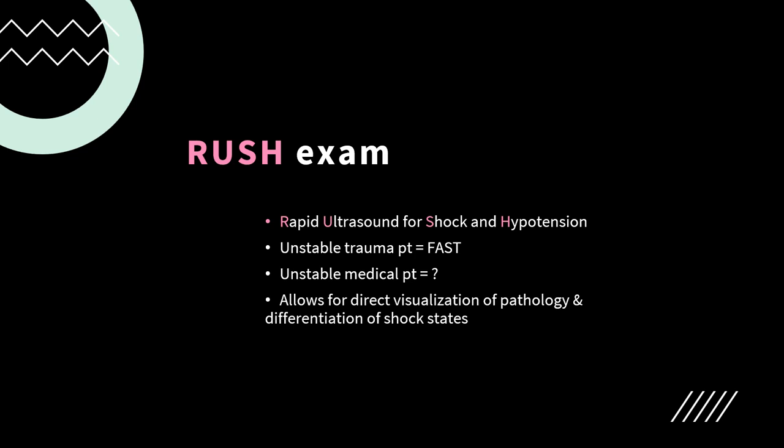People recognize that the unstable trauma patient has a protocol called the FAST exam, but there is no protocol for the hypotensive medical patient. This RUSH exam allows for the direct visualization of pathology and differentiation of shock states.